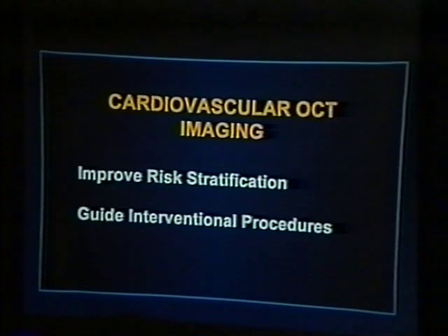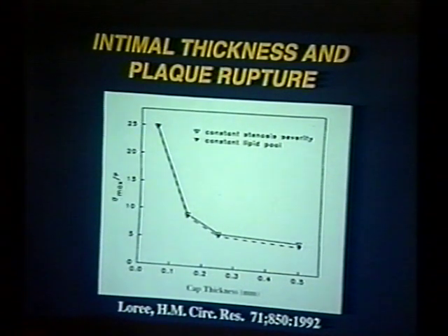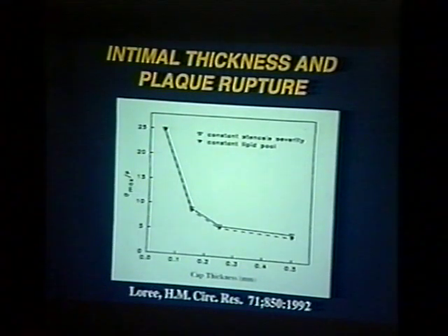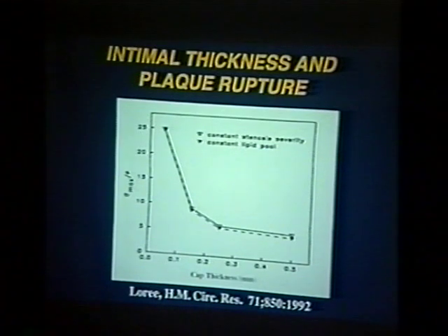Applications. In general, OCT imaging demonstrates its greatest potential in situations where conventional biopsy cannot be performed or is ineffective. Since this is a cardiology session, I'm going to focus on its cardiovascular applications. Starting off with coronary artery disease, there are two areas in coronary artery disease where we believe there's a big role for OCT. The first is in improving patient risk stratification, and I don't know how familiar you are with plaque rupture, but myocardial infarction is the acute loss of blood flow to a region of the heart resulting in death to that heart tissue. It's the leading cause of death in the industrialized world.